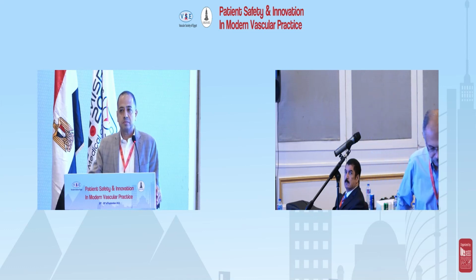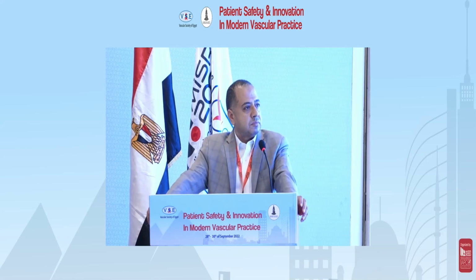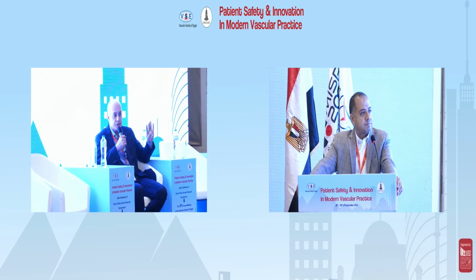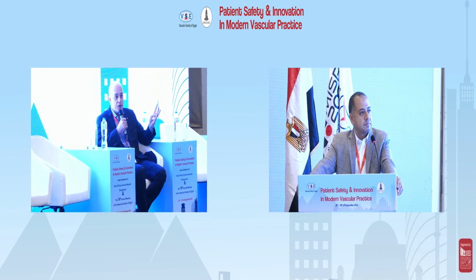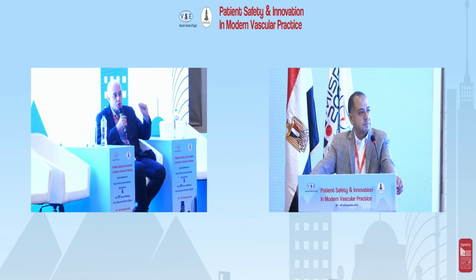Thank you. Well, of course, Dr. Ahmed, we were getting on the way about five years ago. We were about to use zero contrast with the use of the IVUS. But still, at that time, we were not confident enough not to use a small amount of contrast material in order to check before deployment, to make sure that we have no later type 1A endoleak.